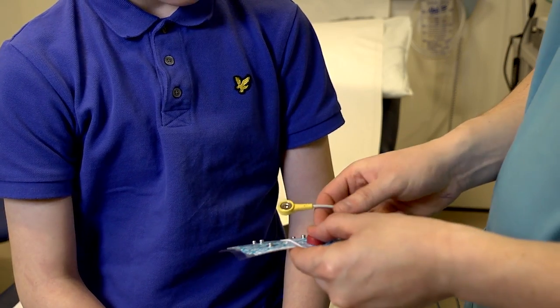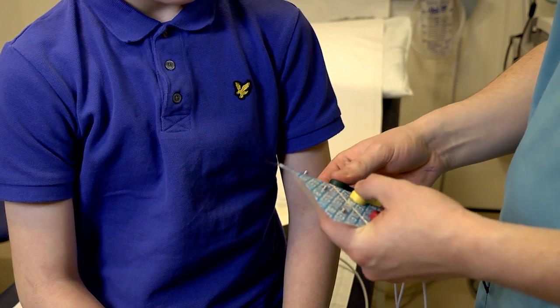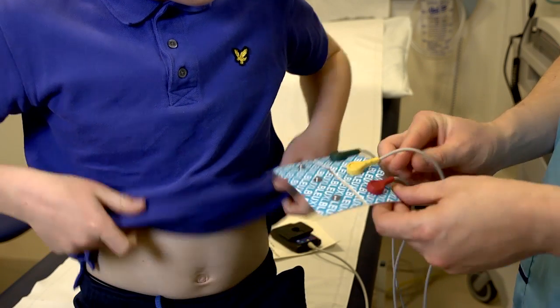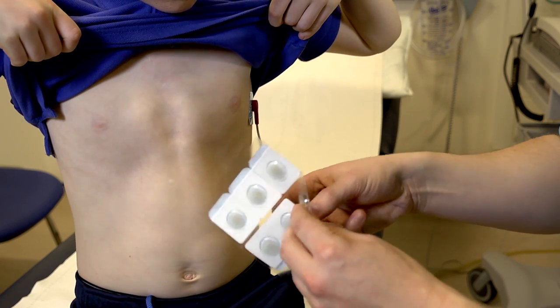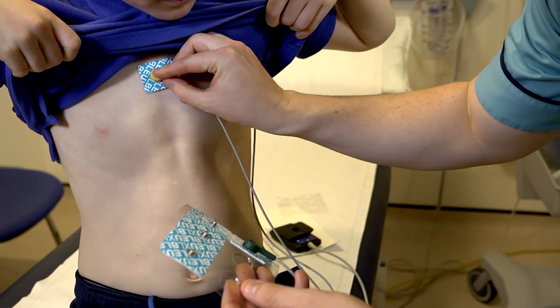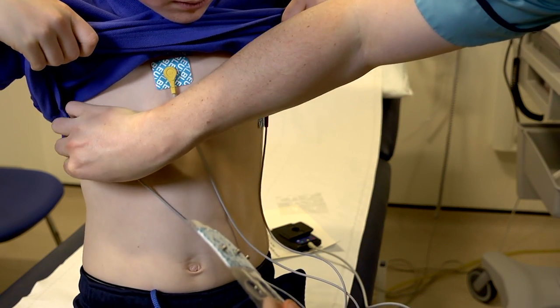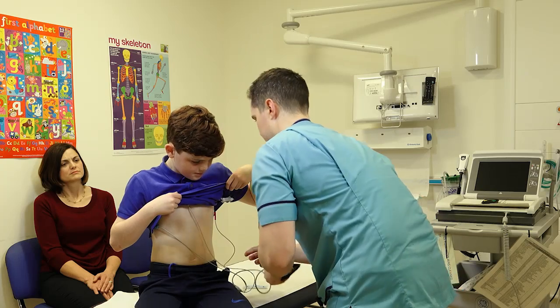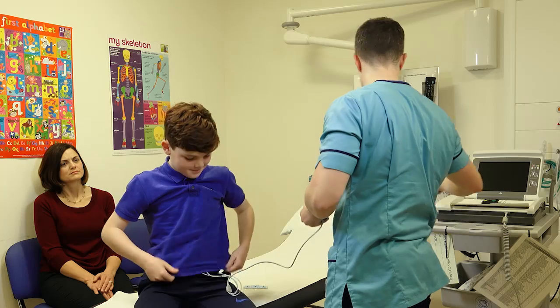There's going to be three electrodes — you can see they're different colours, which means they go to different areas on the chest. If you don't mind lifting your shirt up for me. How does that feel? Yeah, okay, you can put your shirt down now.